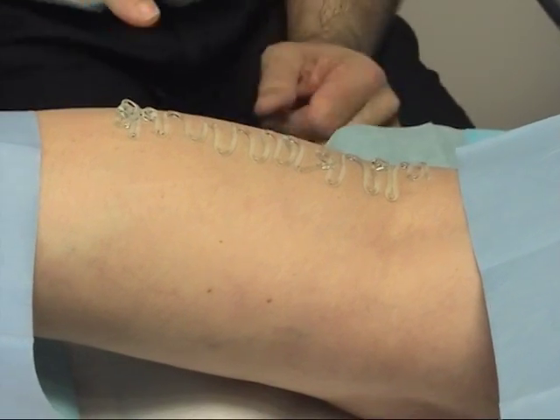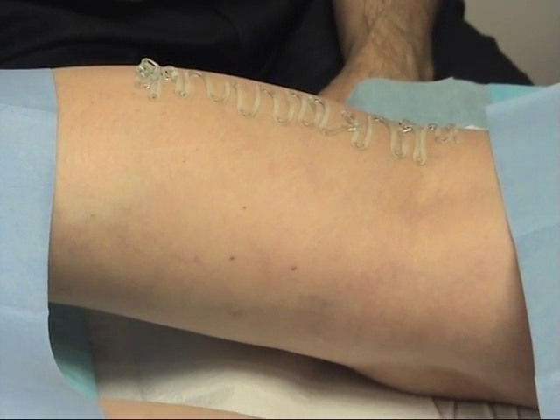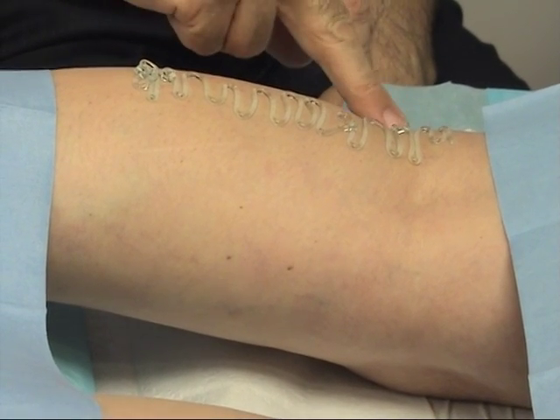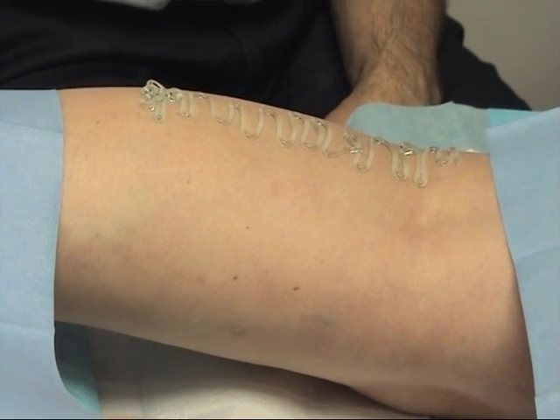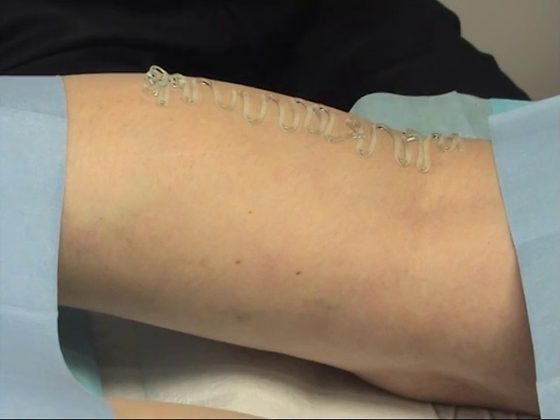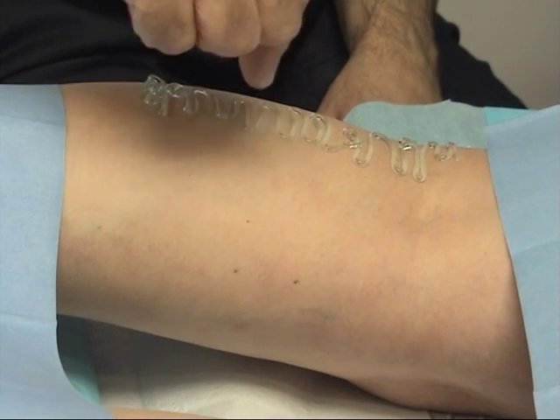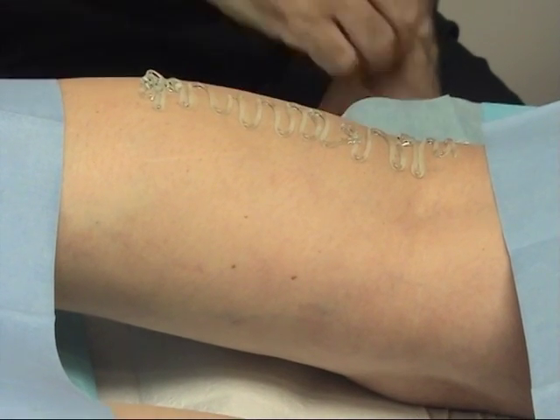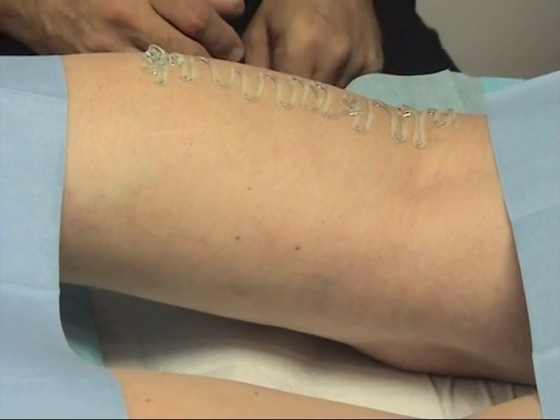What we're going to do is put a little local in here. Then when that's numb, we can introduce the needle in. Then I'll put a guide wire in which will run up to about here. Then we remove the needle and so on, and put the catheter over the top of that. After I pull the guide wire out, we can put the laser fiber in. Once that's sitting in there, I'll put anesthetic all the way around the vein on each side of the vein.